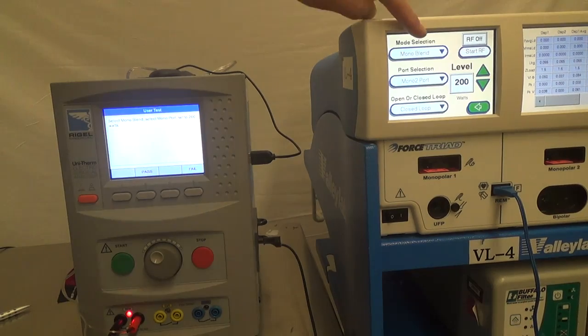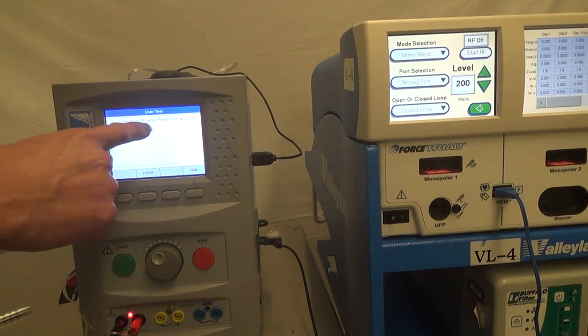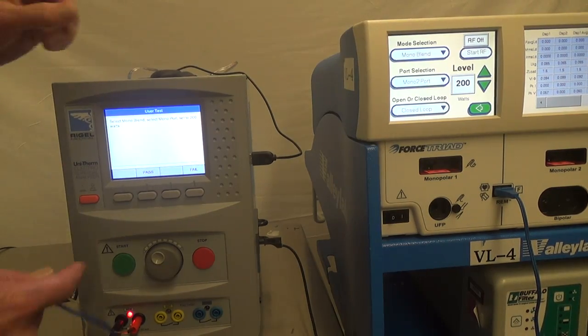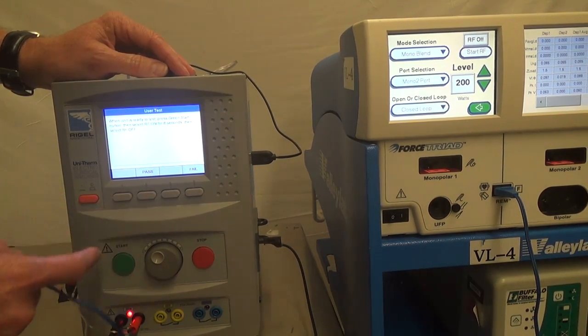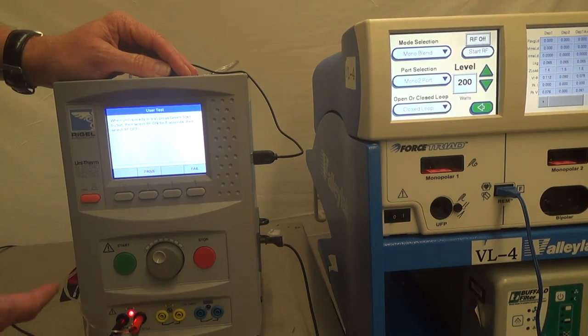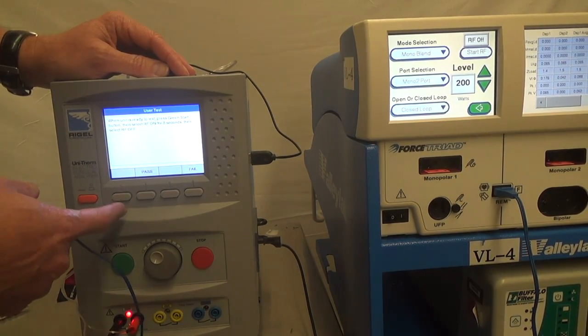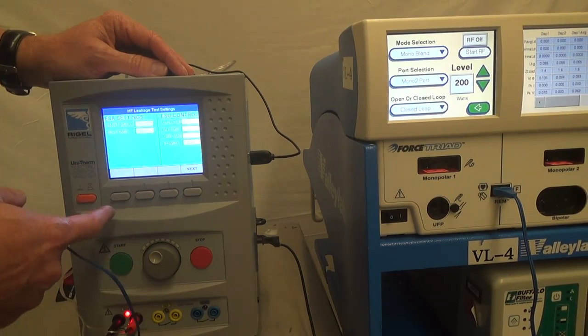And so now that we've done all those things over here, we come back and double check. We're at mono blend. We're at mono port. Set to 200 watts. Press pass. Unit is ready to test. Again, press the start, the green, everything's the same.